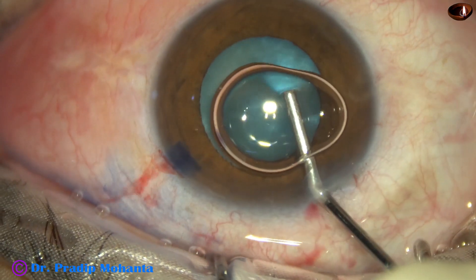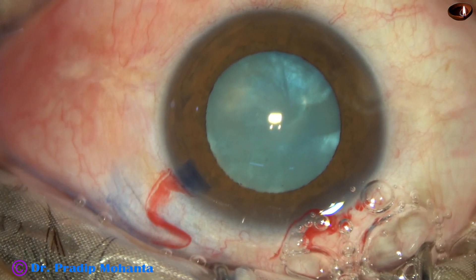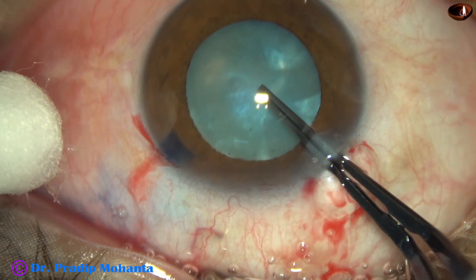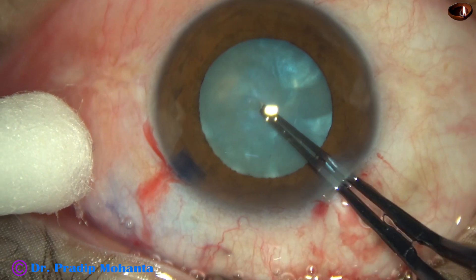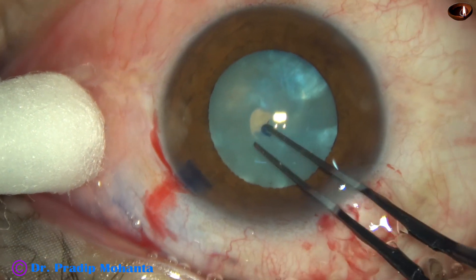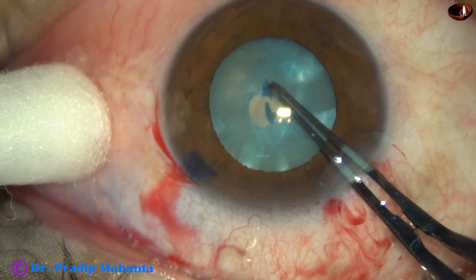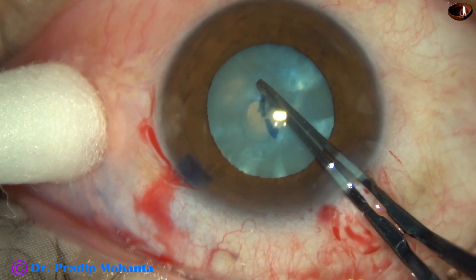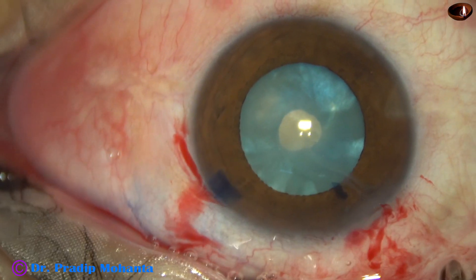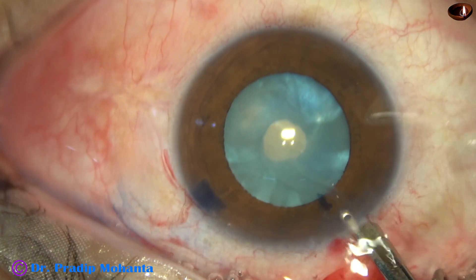But it was not so. We will see that the pupil becomes very small later in the surgery. There is some amount of intumescence in this case, and my plan is to do a small rhexis first, aspirate some lens matter, decrease the intra-lenticular pressure, and then enlarge the rhexis. But as I do this, I find that there is some fibrous sheet beneath the anterior capsule, and it is firmly attached to the anterior capsule in some places.